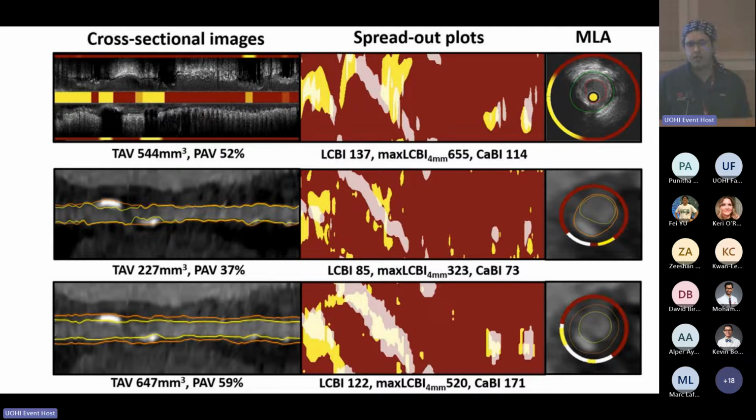In fact, I showed the results for the binary presence of necrotic versus not, but in those studies they also have volume of necrotic core and area of necrotic core per slice. They have that as well, and those are significantly associated. The positive predictive value still isn't great, but the hazard ratio comes up as it hits significance. So it's not a perfect marker, but yes, it does seem to add something on top of stenosis.